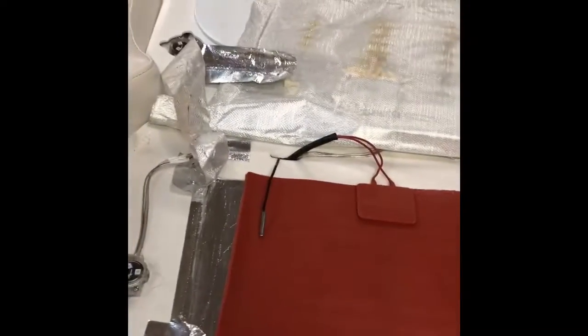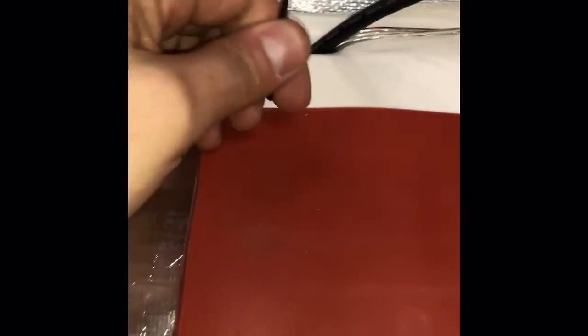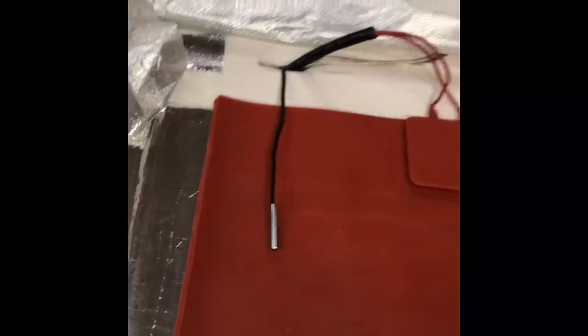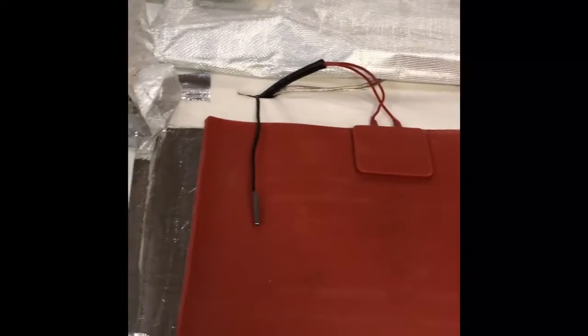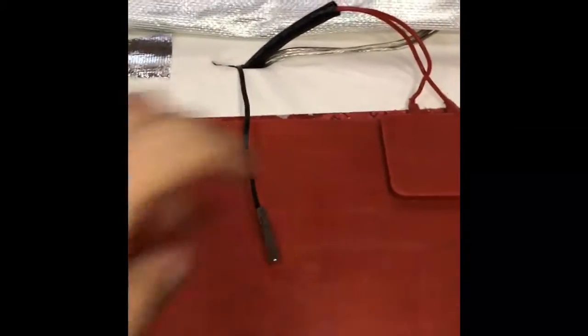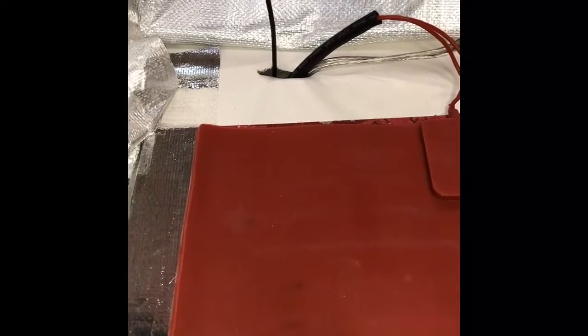So the last step is we're gonna go ahead and check for the thermal fuse. This guy right over here. What it does is pretty much when the pad heats up all the way, this is the sensor to it, which cuts it off so it doesn't get too hot, so the pad doesn't melt. This is pretty much the start and the stop sensor. So we're gonna go ahead and trace it down the same way.